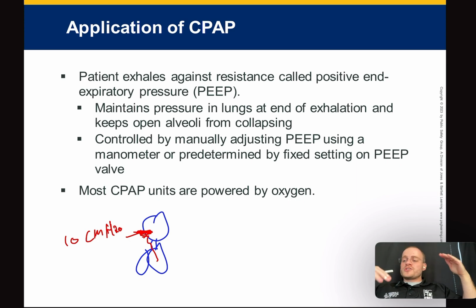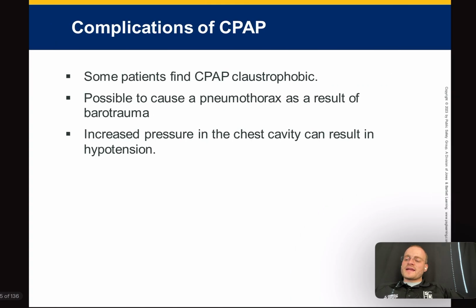And so we adjust this whole PEEP number somewhere between 5 and 20, right? 5 starting out, 20 is the highest end of that spectrum. And that's how we decide our clinical intervention. And so really you want to set this to what the patient can tolerate. Usually I find that mostly 5 or 10 will do fine. So of centimeters of water or PEEP. So this is how that's done.